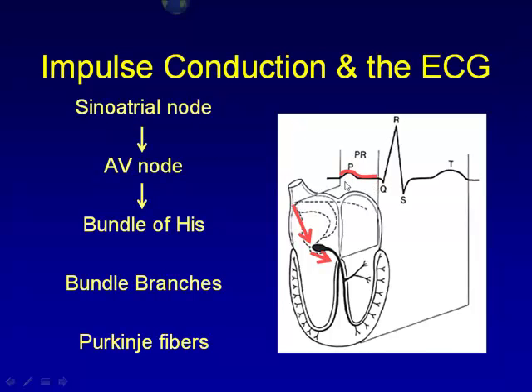The PR interval tells us how much time it takes for the impulse to be generated and then conducted to the AV node, or atrioventricular junction. Then the impulses go through the right and left bundle branches, and when they depolarize, that means the ventricle is depolarized, so it appears as a QRS complex. When the ventricle is depolarized, the atria starts to repolarize, but it does not appear on the ECG machine because the strongest events are for the ventricle, so it appears more predominant.